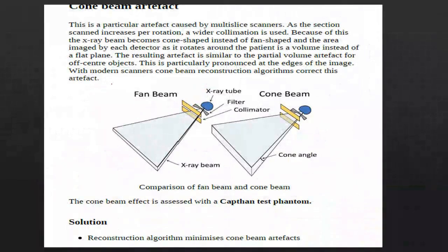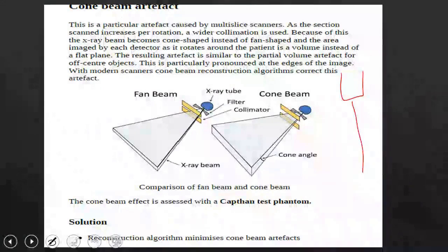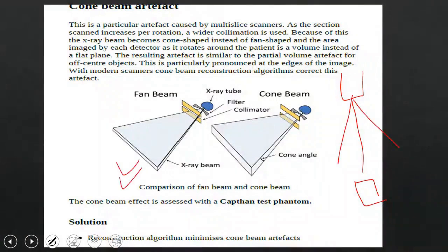So, what about the topic of the cone beam effect? In the past, they used a thin beam of radiation and an ideal detector, like when you hold a laser pen and it emits a thin light. Then the topic evolved, and in this form, we are at the z-axis level. We know there are two dimensions. One is the x dimension, and the other is the thickness dimension, which is the z dimension where the patient lies down. This is the part that you spread over the patient or covers your area.